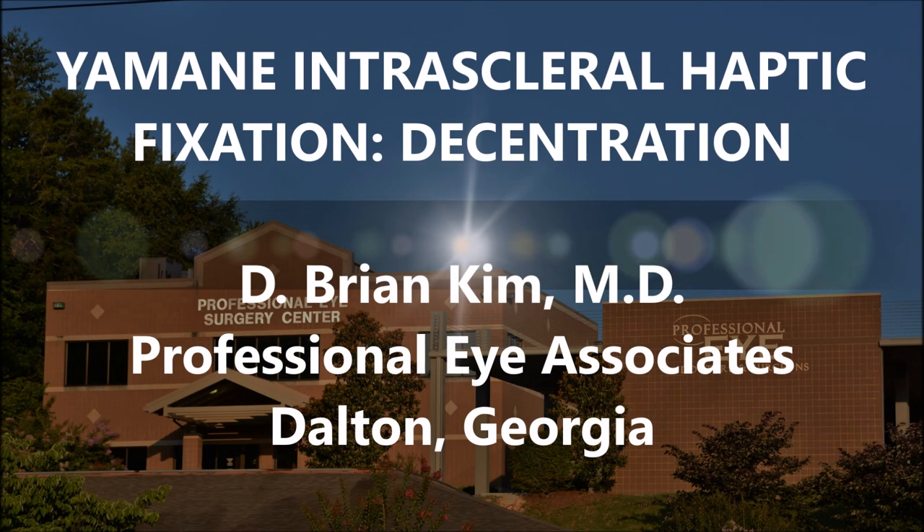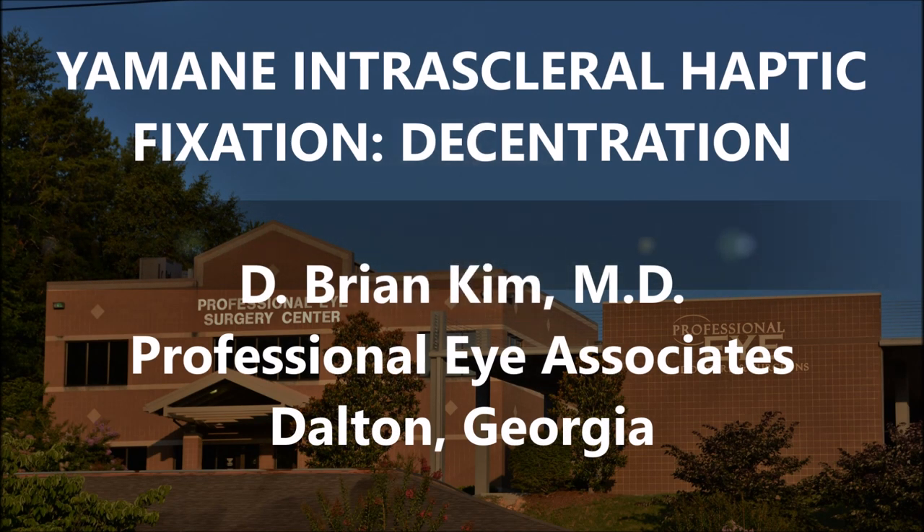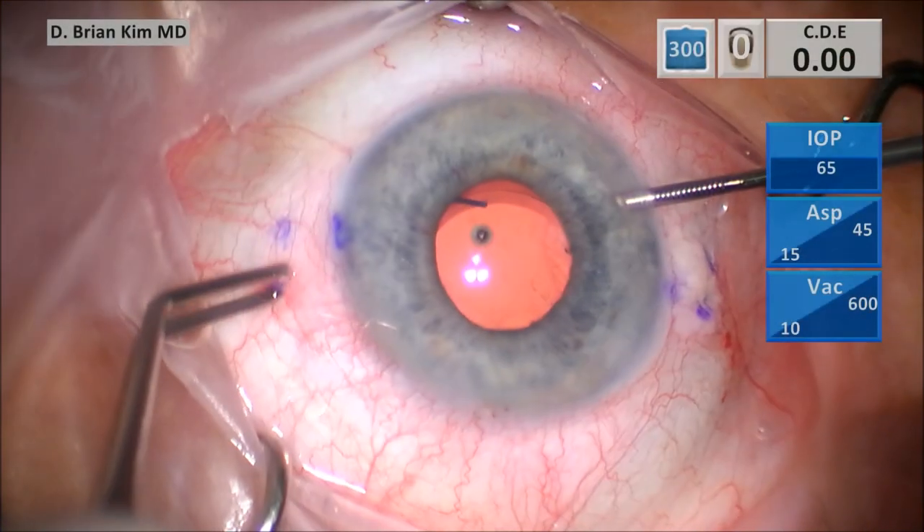Hi, this is Brian Kim, and I'd like to share with you an addendum to my last video on the Amani intrascleral haptic fixation technique. If you notice in that case, I actually had a little bit of decentration of the lens implant. I want to go over why and how this happened.